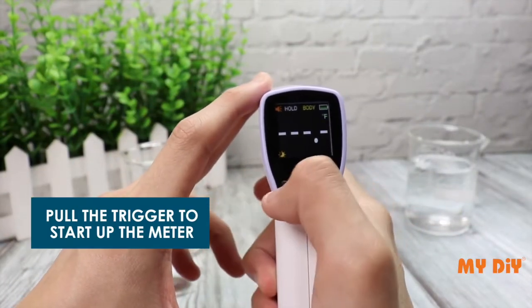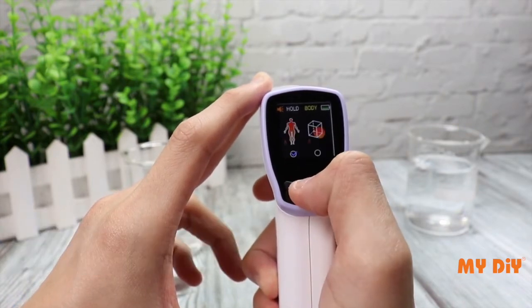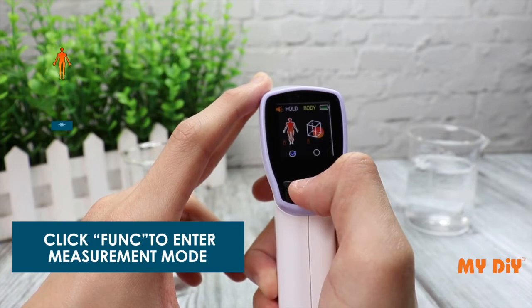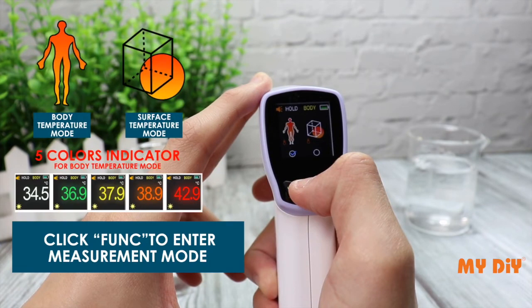Pull the trigger to start up the meter. Change the temperature unit by pressing the unit key. For changing mode, press the funk key once. There are five color indicators for body temperature mode.